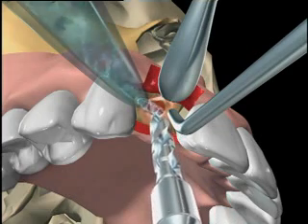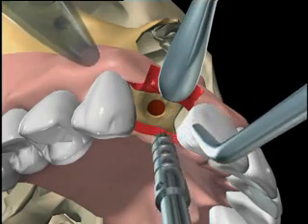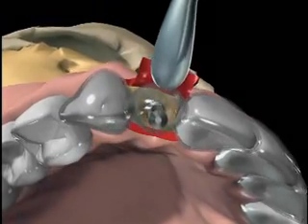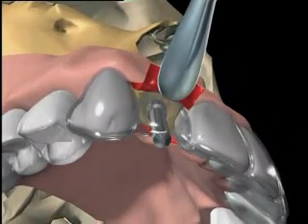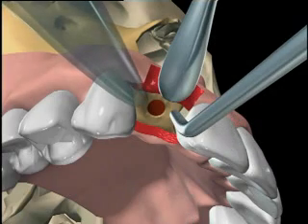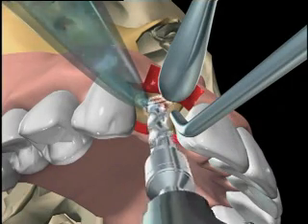This graduated drilling sequence is required in all implant cases as a means of limiting the amount of heat generated during drilling, while also providing steps to check the accuracy of the osteotomy during excavation. The larger side of the parallel pin is used after the intermediate drill to verify the relative position of the implant site. The tapered screw vent implant features surgical protocols for both soft and dense bone.